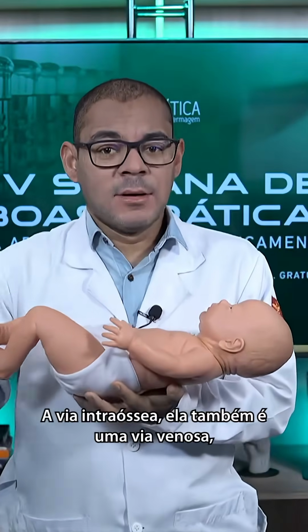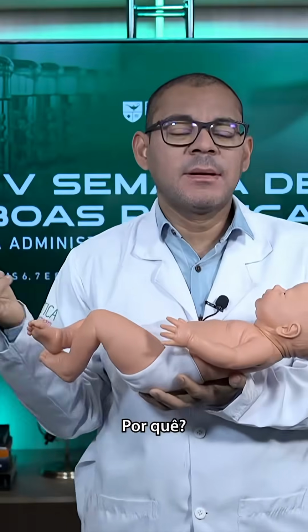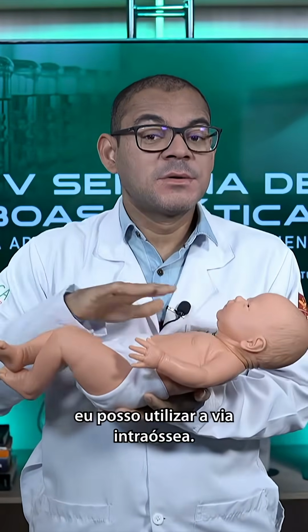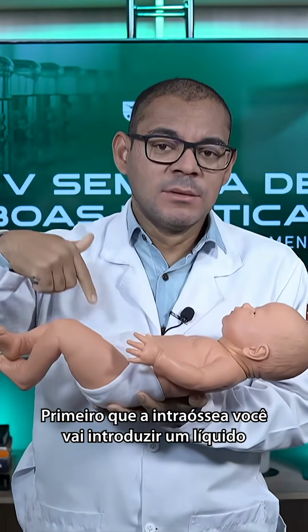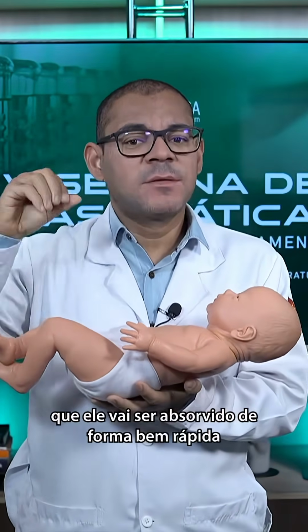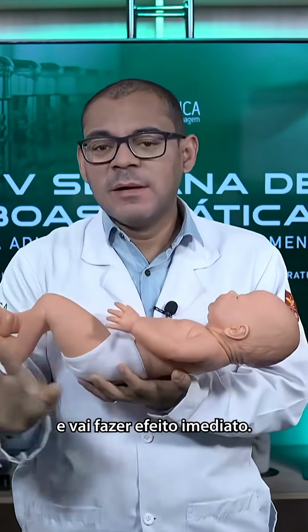The intraosseous route is also basically like an intravenous route. Why? Because just as I use the intravenous route, I can use the intraosseous route. What's the difference? First, with the intraosseous route, you're going to introduce a liquid directly into the patient's bone, which will be absorbed very quickly into the venous system and will have an immediate effect.